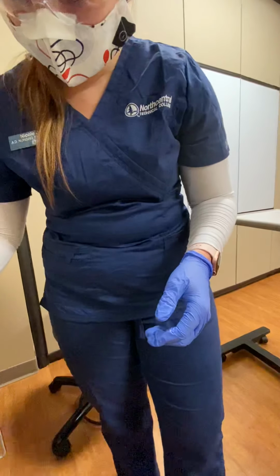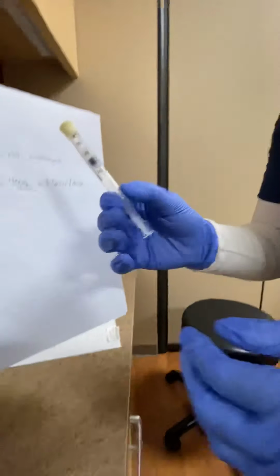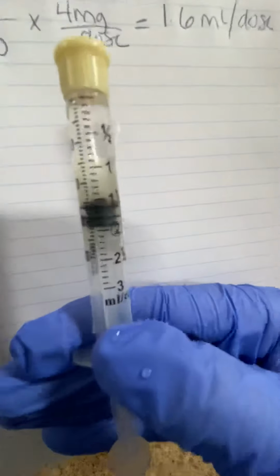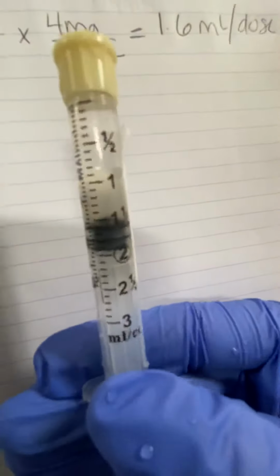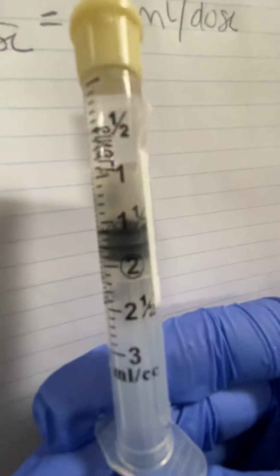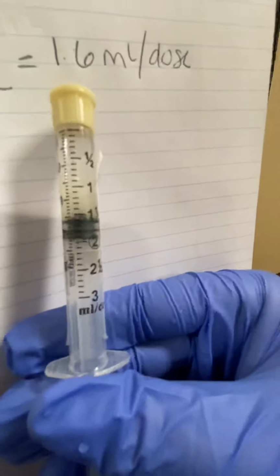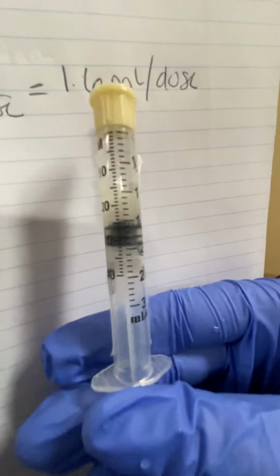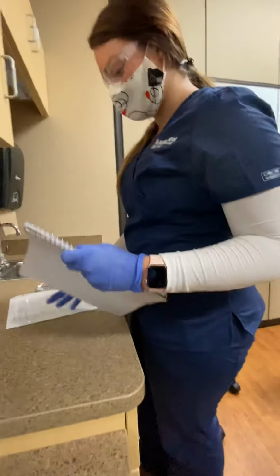Okay. Alright. Sorry for getting your paper wet. Okay. So I'm at 1.6. Try to turn it. There, I think you can see it. Have to turn it at one of the angles. Alright, 1.6. Okay. So now that I'm dose accurate, I'm going to do my checks.